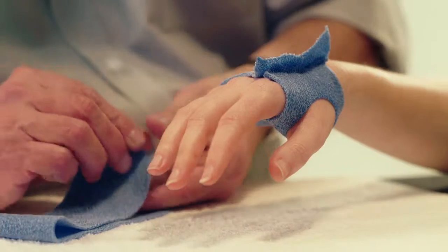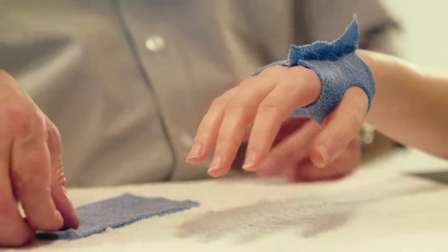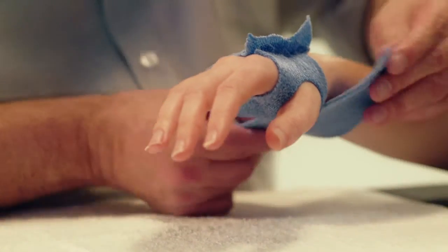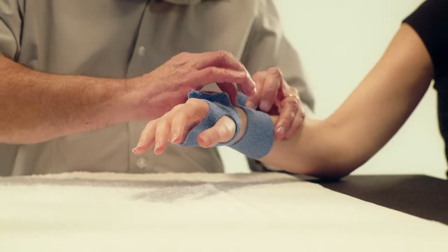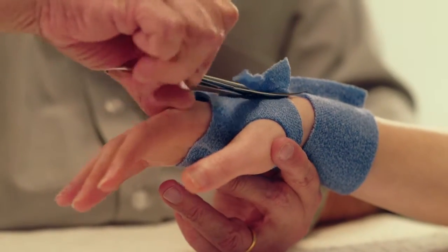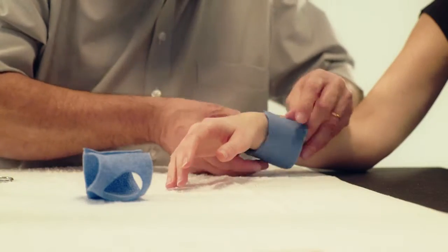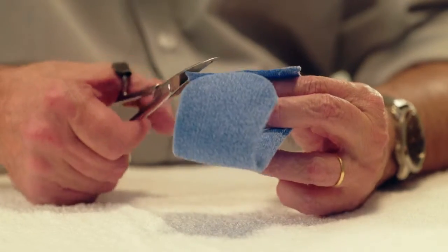Take the second strip of Orficast, fold it in half and wrap it around the distal part of the forearm. Pinch it together on the dorsal surface of the forearm. Let both pieces harden. Cut away any excess material on both parts. Trim the edges and round the corners.